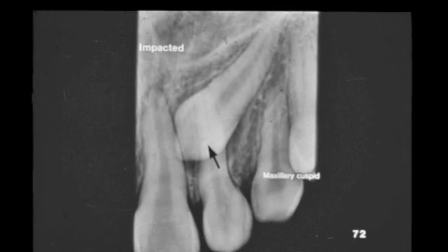The permanent maxillary canines are commonly, or not unusually, impacted or ectopically erupting. The primary canine is present — letter H. Notice the attrition on the incisal edge, the large bulkiness on the cervical of the crown, and the shorter root.